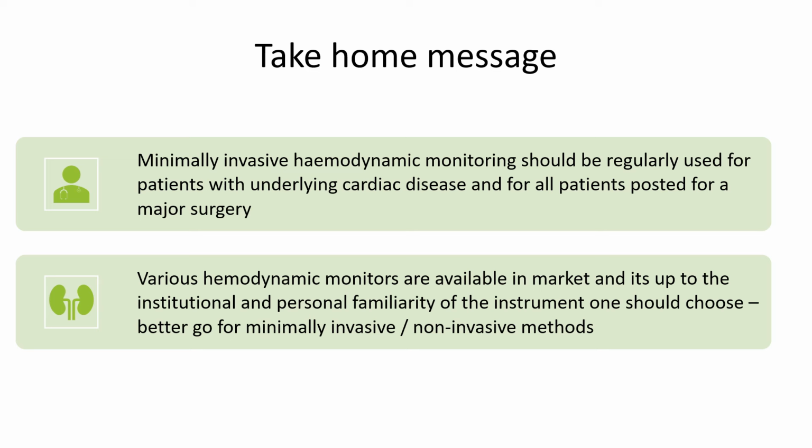It's a class 1 recommendation as well. There are various hemodynamic monitors available in the market, and it's up to your institutional and personal familiarity with the instrument and the technology that you should choose. The more familiar you are with the monitor and the technology, the better decisions you can make at the end of the day.